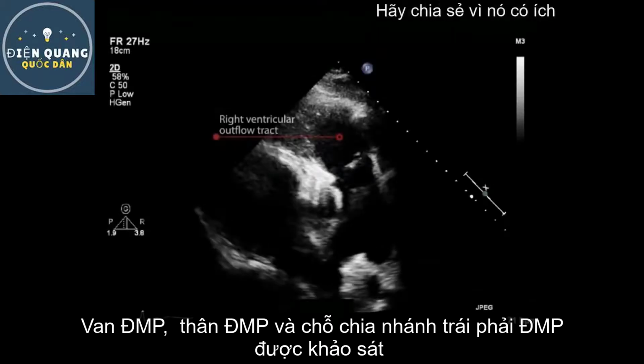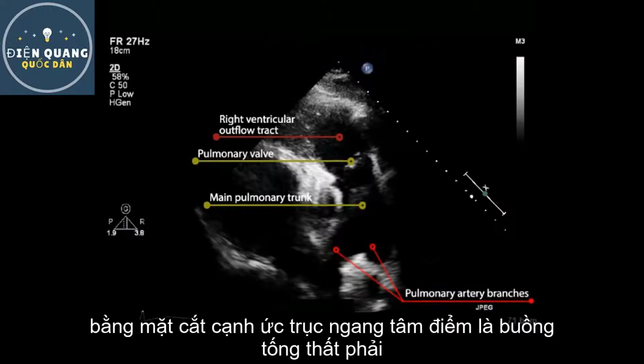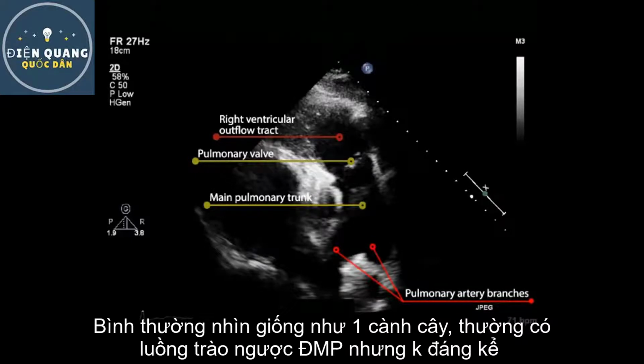The pulmonary valve, main pulmonary trunk, and branches of the proximal pulmonary artery are visible in the parasternal short axis of the right ventricular outflow tract. In the normal subject, these are thin-walled structures, and at most there is a trivial amount of pulmonary regurgitation.